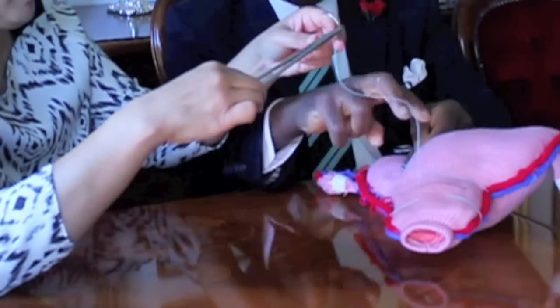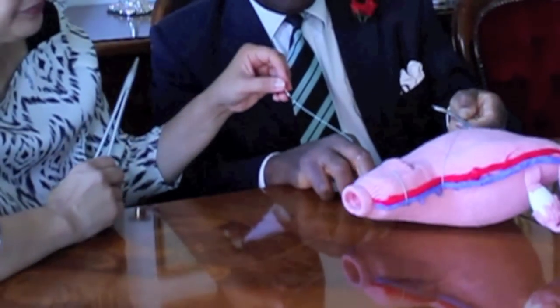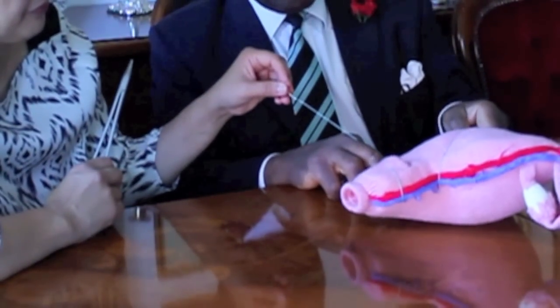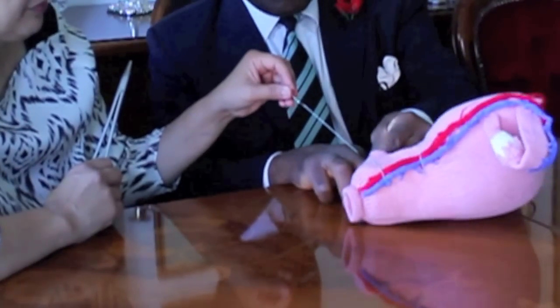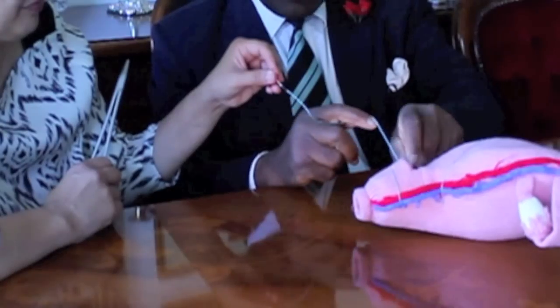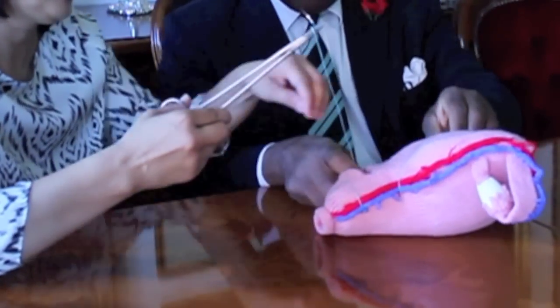By doing so, an important demonstration: you have occlusion of the upper part of the vascular system and occlusion of the lower part of the vascular system. The suture runs through and comes into the cavity of the uterus on the other side.